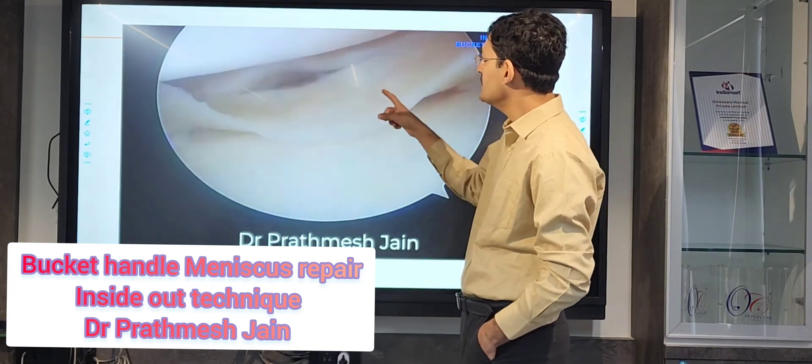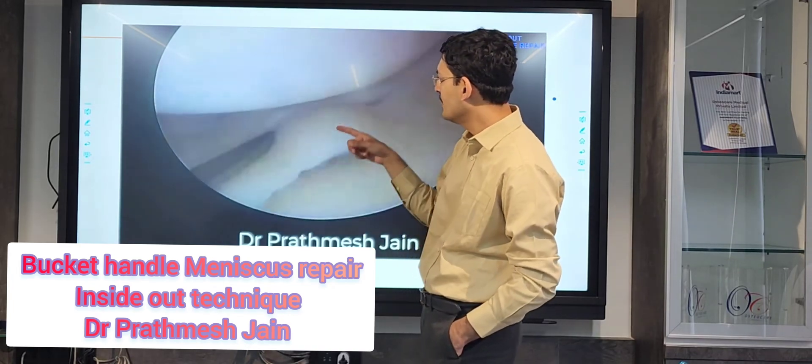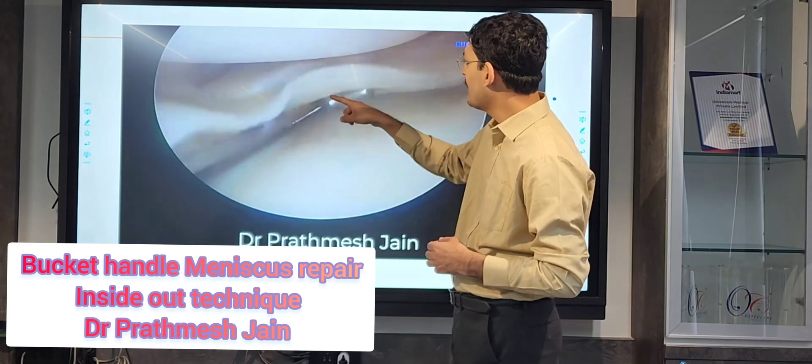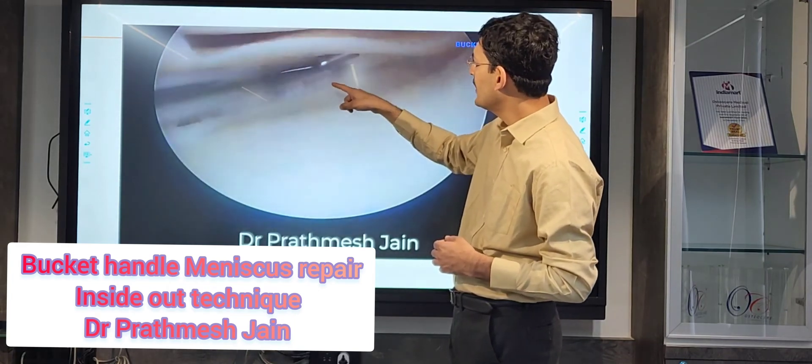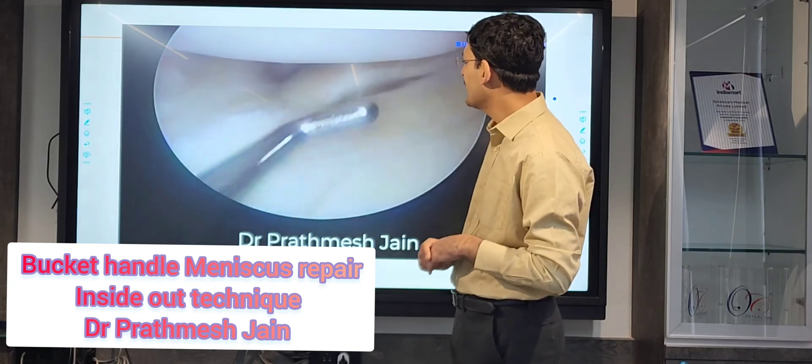We want to repair the anterior zone as well as the posterior zone. This is called a double bucket handle pattern — you have two levels of tear, one anteriorly and one at the back.